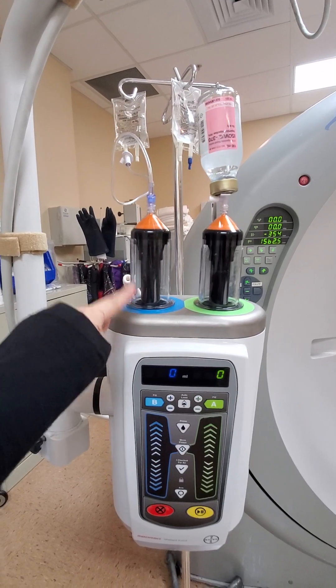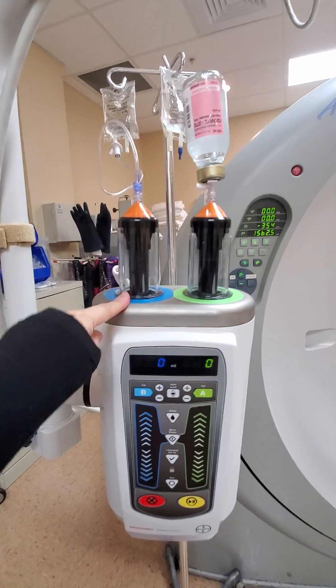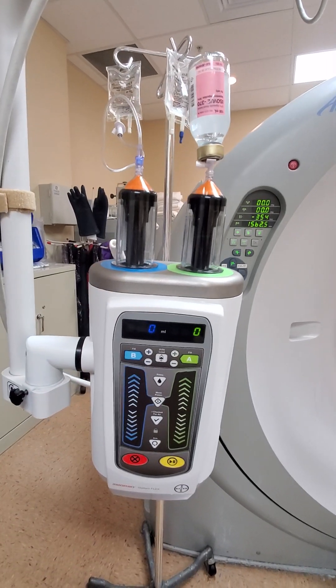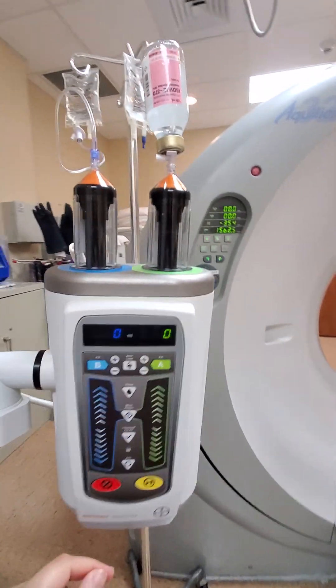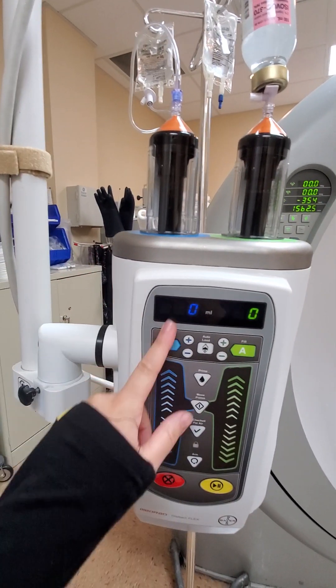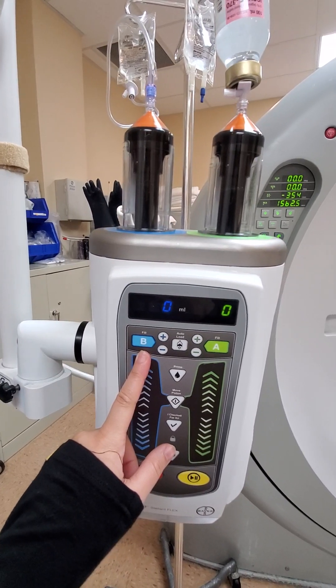Blue is always going to be saline — blue saline. So I'm gonna load up 100 cc's on the contrast side and about 55 cc's on the saline side.